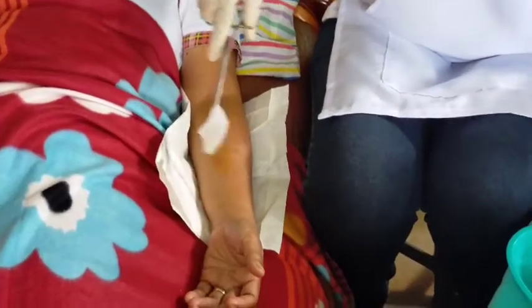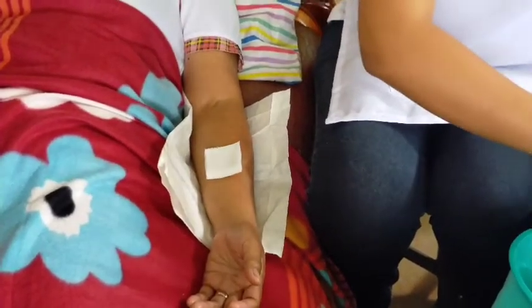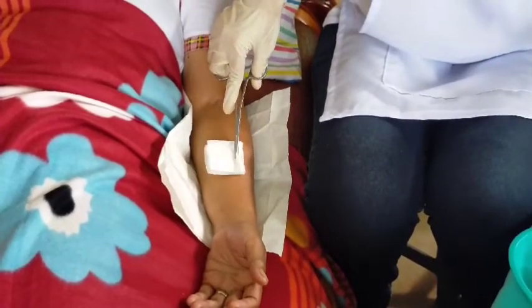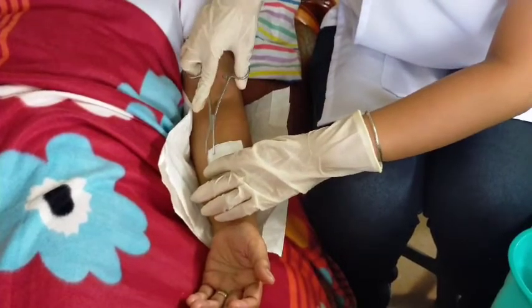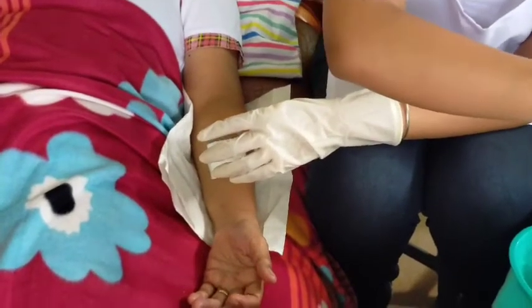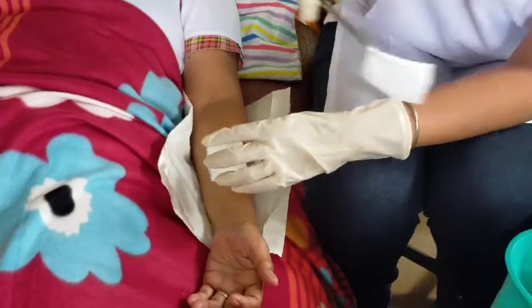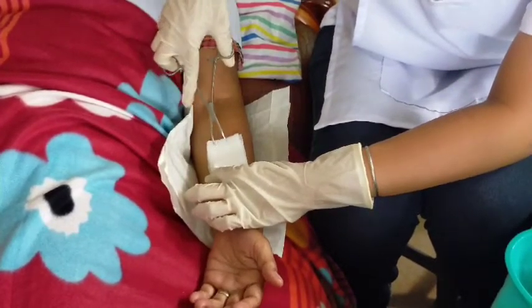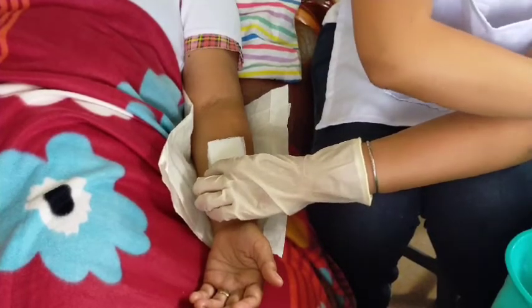Now, we're going to apply a layer of dry sterile dressing over the wound. Forceps can be used to apply the dressing. And we're going to place the second layer of gauze over the wound site. You can apply a surgical or abdominal pad over the gauze at the site as the outermost layer of the dressing.